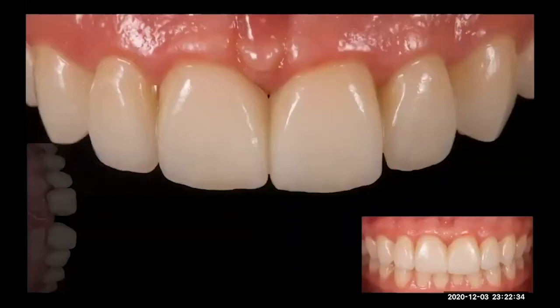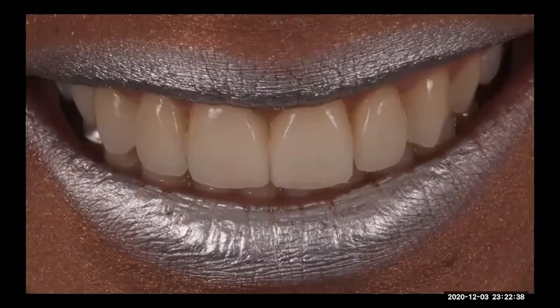This is a week control. This is an 8 months control. You can see the movement in the teeth, the individualization between each restoration. We are always focusing on nice gingival contours, nice incisal embrasures, and trying to make everything more natural, not like piano keys or something in one color.